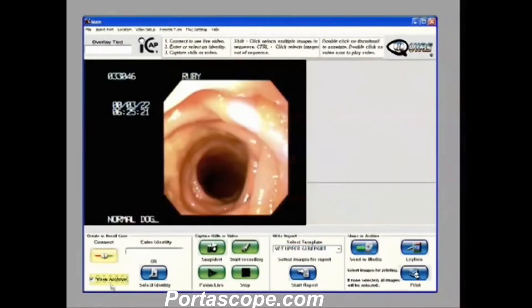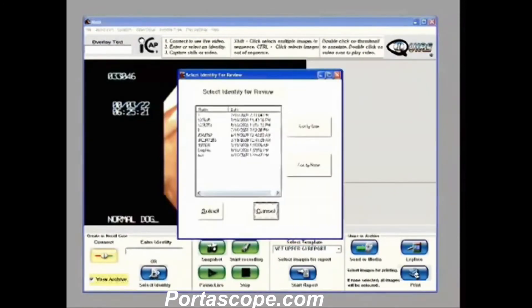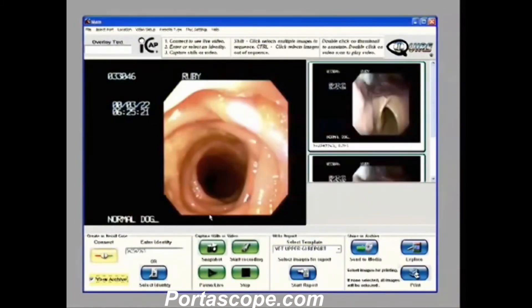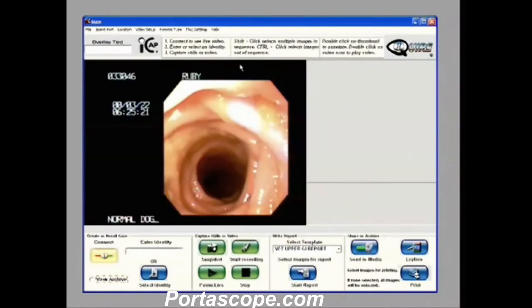To get them back, we simply click View Archive, hit Select Identity, and here are all the archive folders. From here we can do the same thing — we can load them, view them, and annotate them. This concludes our demonstration. We hope you find iCAP to be as easy to use as we tried to make it.